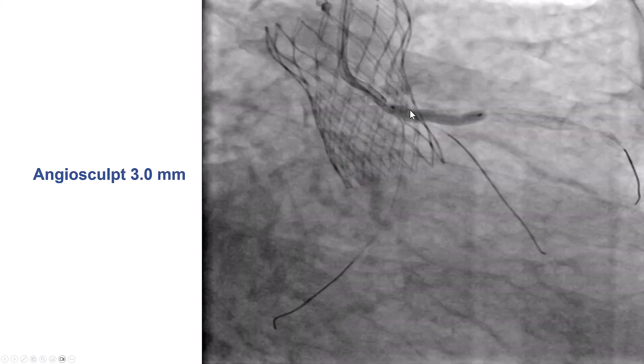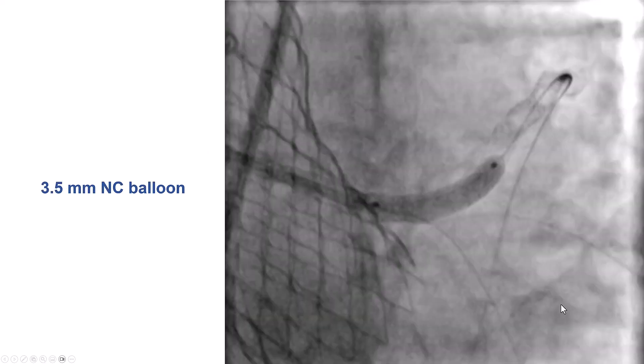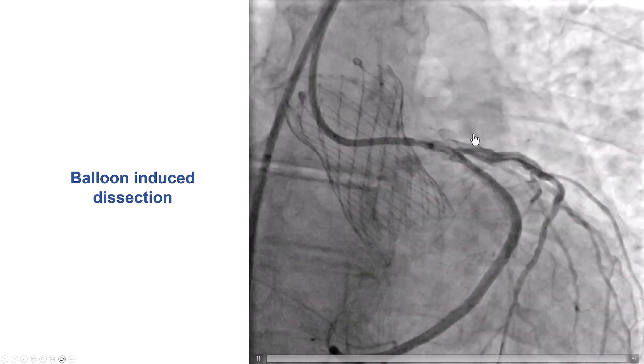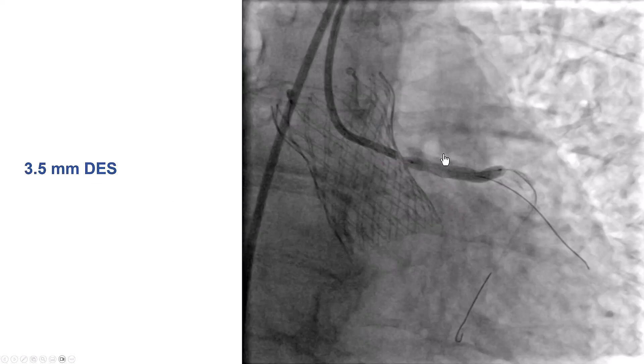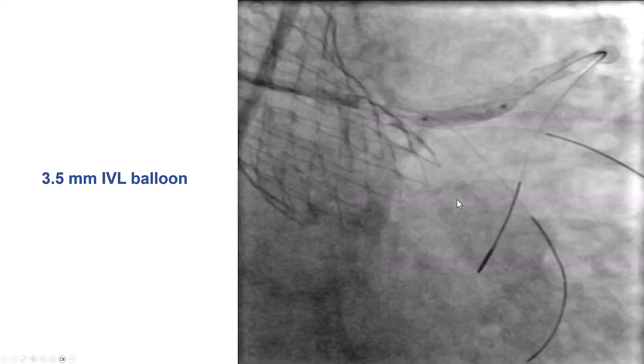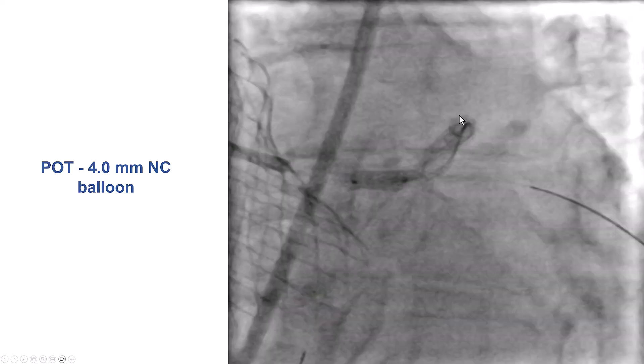We then predilated with an AngioSculpt, keeping the guide wire in place, and used a 3.5 mm NC balloon that seemed to expand well. There was actually some dissection of the proximal LAD. We then proceeded with provisional stenting using a 3.5 mm drug-eluting stent deployed from the left main into the proximal LAD. However, the expansion was suboptimal. So we went back and did intravascular lithotripsy — we didn't want to do any atherectomy since we had a fresh stent. The patient tolerated the lithotripsy pretty well.